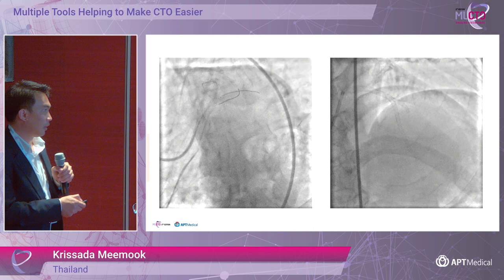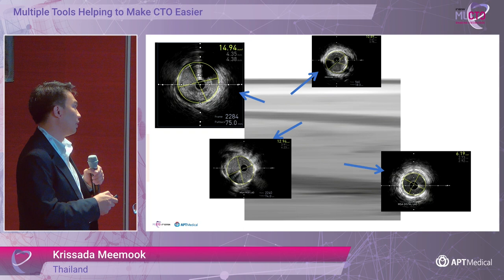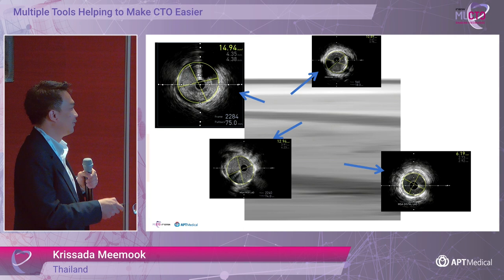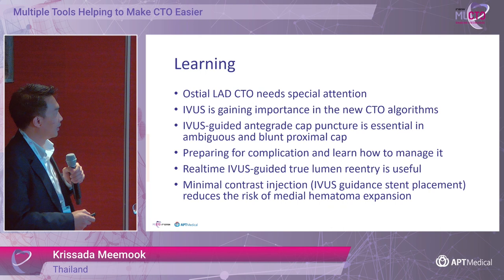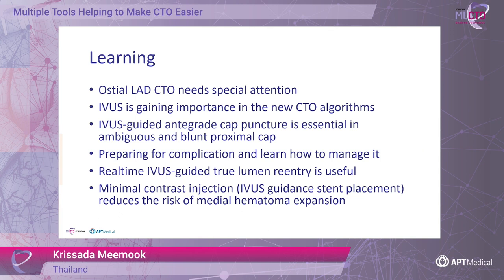This is the final result after placing four stents with DK crush on diagonal 2. This is the final IVUS image. On the left main, the area is about 15 mm². This is the proximal LAD, circumflex, and mid-LAD stent — the area is really acceptable. This is the learning point from this case: everyone knows the ostial LAD needs special attention because it is like left main disease.